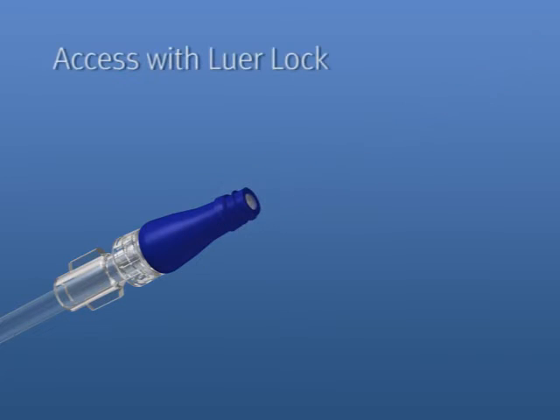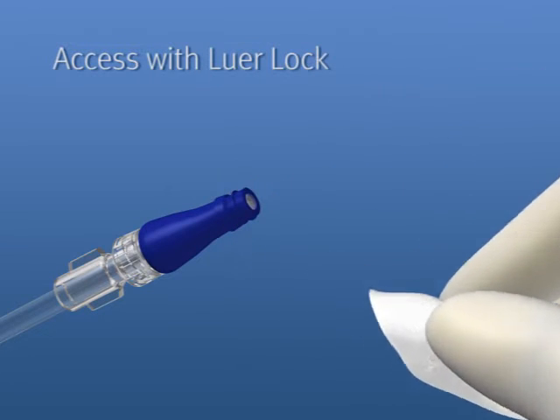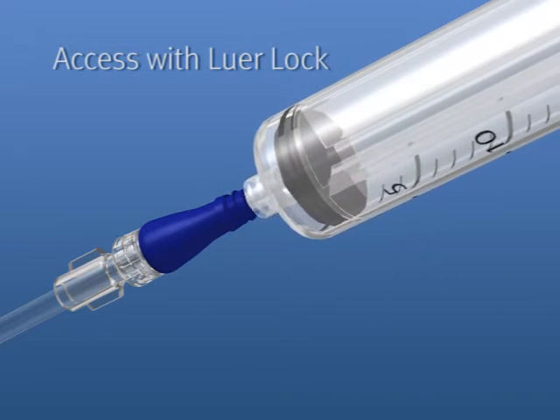To connect to the Microclave using a lure lock syringe, swab the top of the connector with alcohol and push and twist the lure until secure.